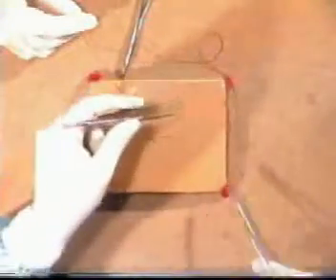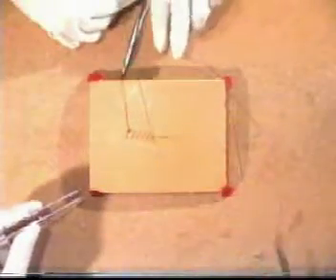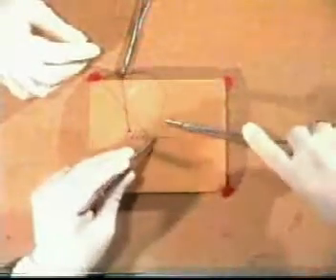As one continues along the incision, it is important that the suture material does not get caught around instruments, as you see here. And your assistant should remain alert to such a danger.